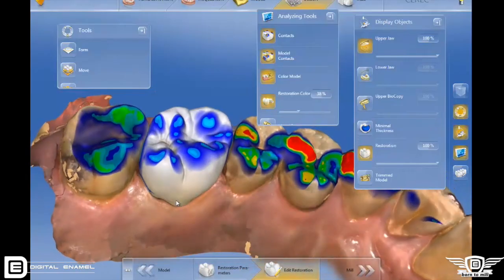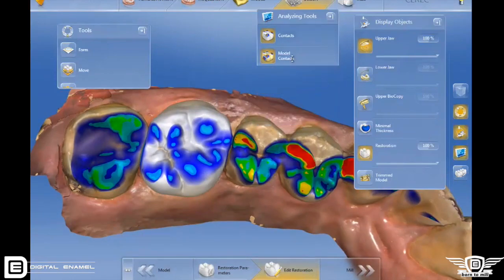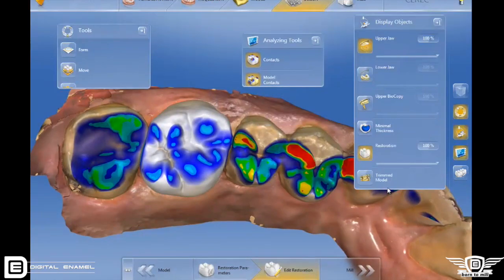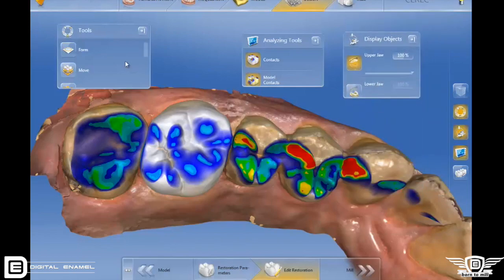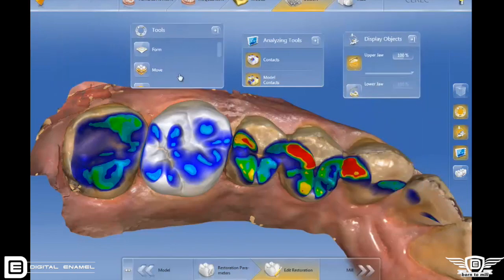There are new side panels in the design phase — this is awesome. At first I didn't like them because they look so strange, but now I can't live without them. They make it a lot easier and faster, so you can select individual tools. The display objects are right at your fingertips, and the analyzing tools are even easier to find. It makes it faster and easier.